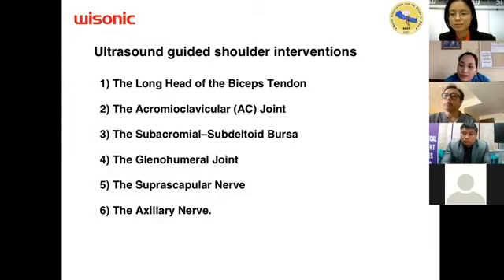The clinical examination helps us in a big way to narrow down our differential diagnosis and then plan our intervention accordingly. If after clinical examination you suspect any pathology and you do your ultrasound scan and see some finding and you're not sure, it's always better to send for some clinical investigation as well as do some imaging study to confirm your diagnosis before planning your interventions.